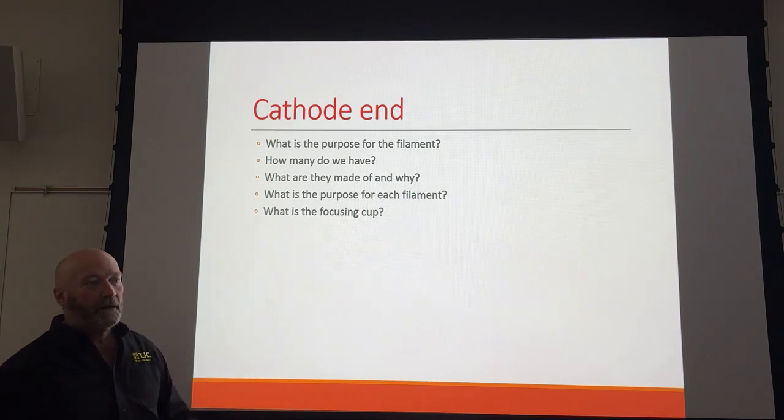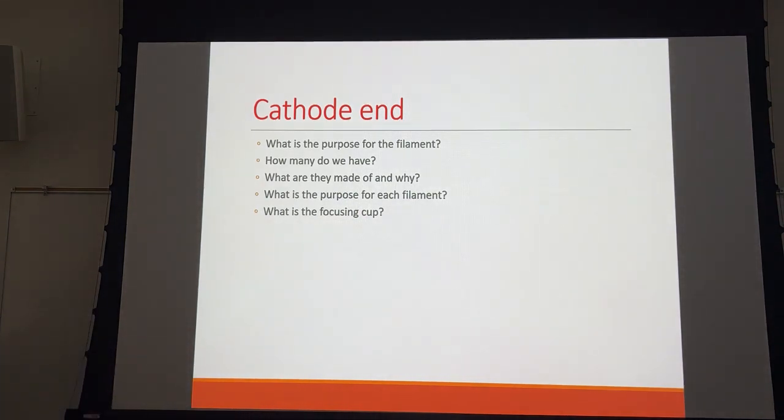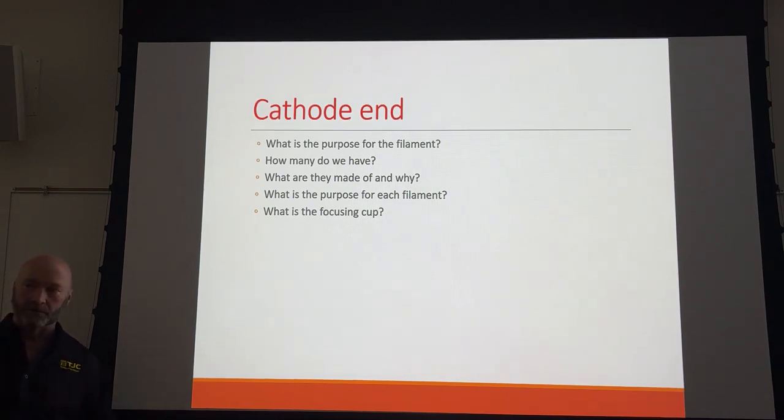It's good, right? That's kind of an extreme example, but a large focal spot, the purpose for the large filament is so that we can stack a lot of electrons on it, but what we lose is some sharpness of recorded detail. It's not going to be as dramatic as fluorescent lights or an overcast day, but we do lose some sharpness of recorded detail with a large filament. What we gain is an ability to create high mAs exposures.